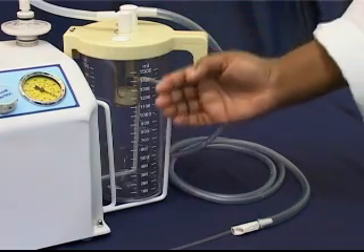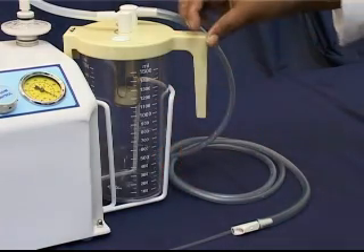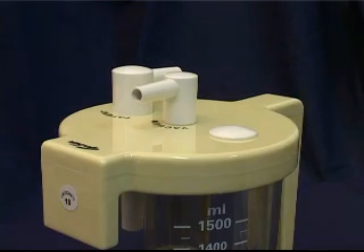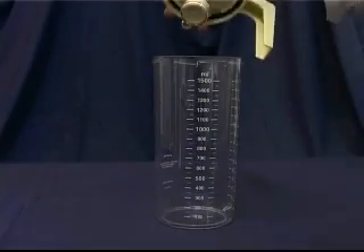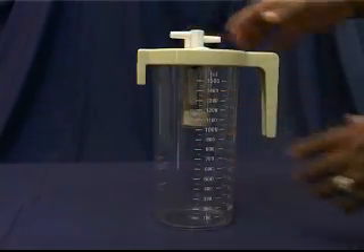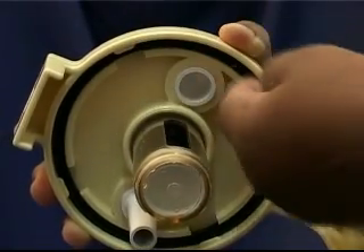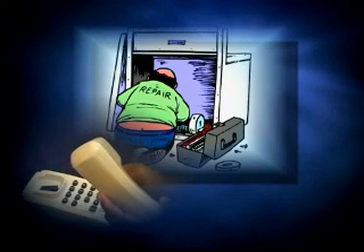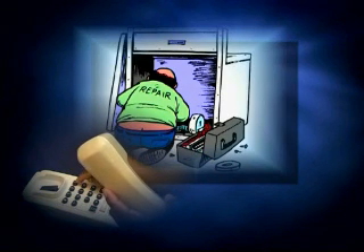If you find that there is no suction available despite a kPa reading on the gauge, check and clean all tubing and tubing connections. Check the bottle and fit it properly. Check bottle gaskets and clean if necessary. If the problem persists, report the fault so that a qualified technician can be contacted.